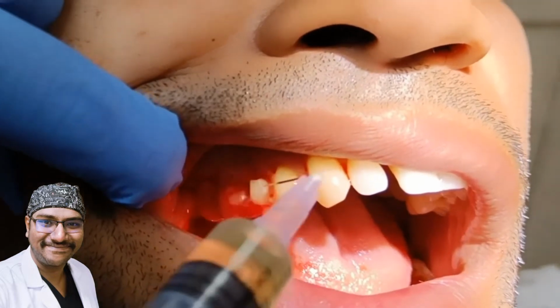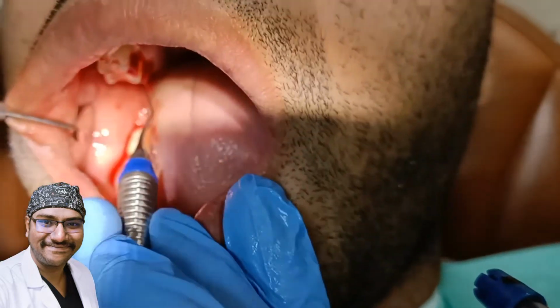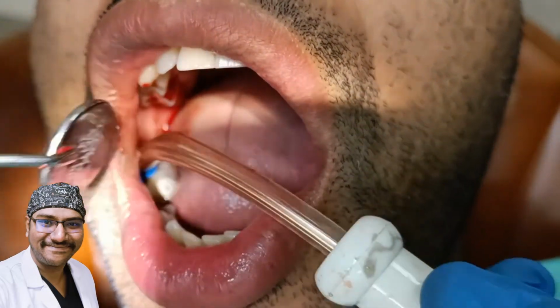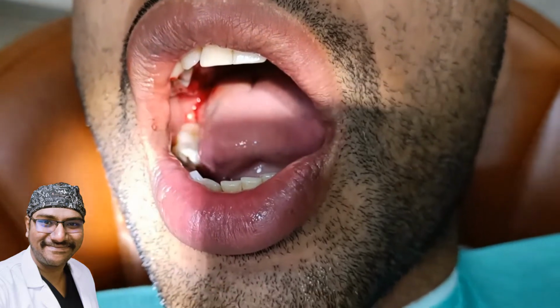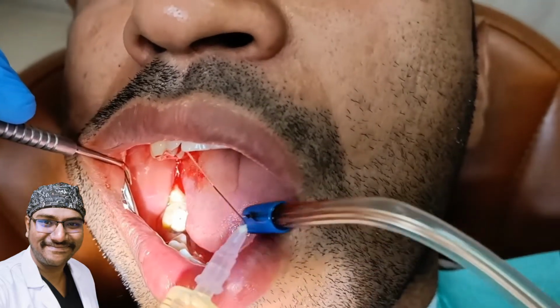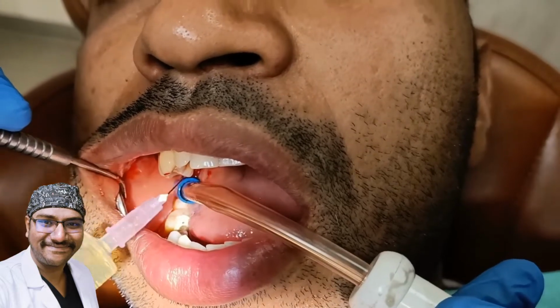Root planing and curettage can be done in sequential order, such as quadrant wise, split mouth, or sometimes full mouth if the need may arise. Now you have to understand that the need of root planing and curettage is very pivotal when it comes to the outcome of the surgery. The more thorough the root planing and curettage is done, the more the surgery time is likely to be reduced and the healing post-op is likely to be much better.